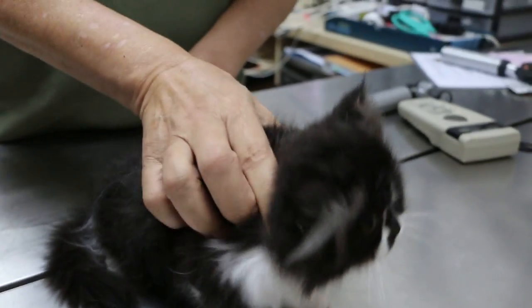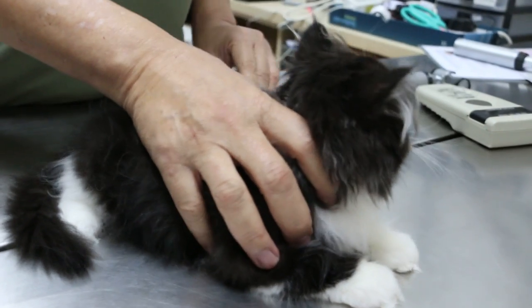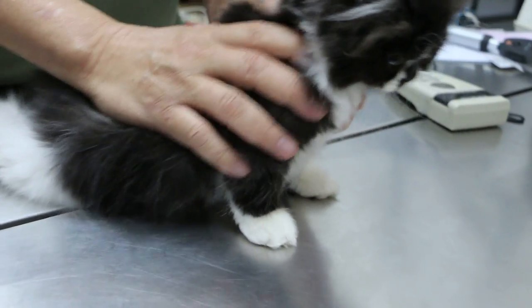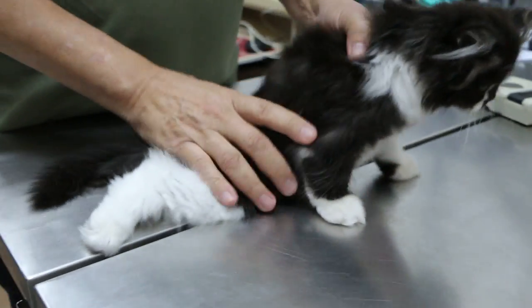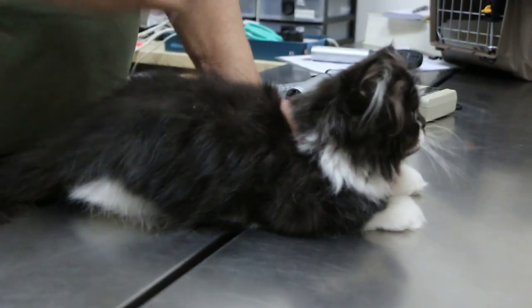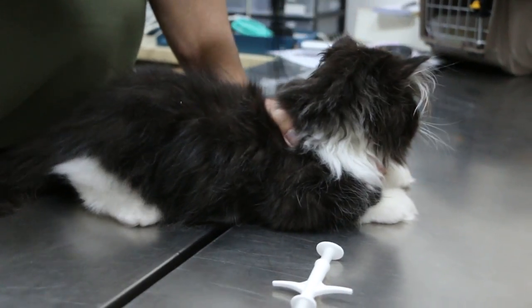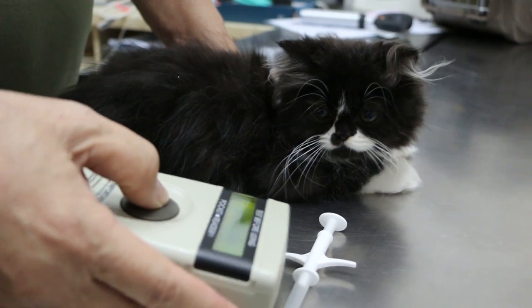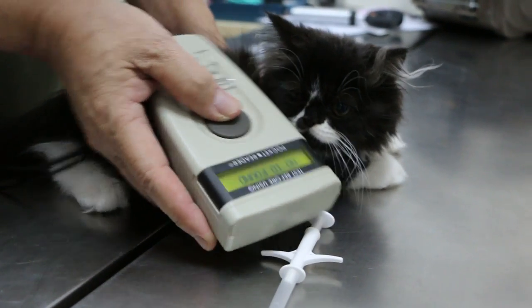Okay, now I'm going to do the microchip. I'll do a microchip. Naja, come here. Hold on first, relax. Let's relax first. The microchip is scanned. Make sure the microchip is normal.